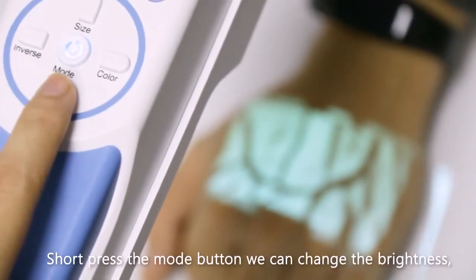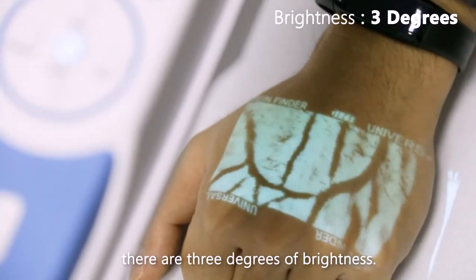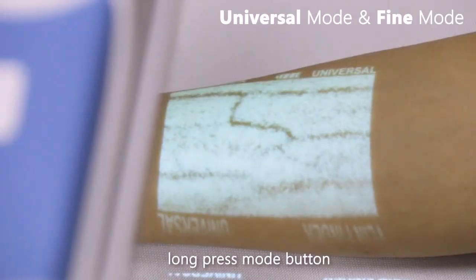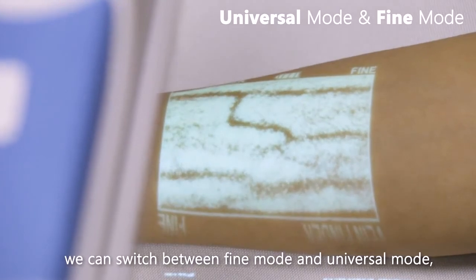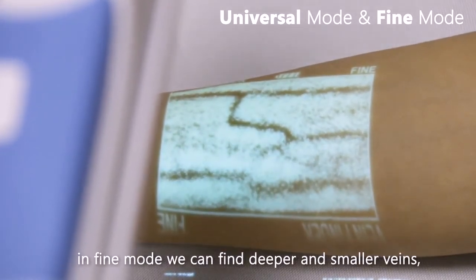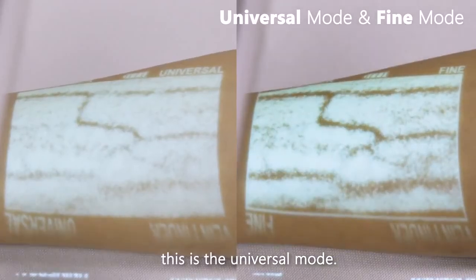You can also change the brightness — there are three degrees of brightness. Long pressing the mode button allows you to switch between fine mode and universal mode. In fine mode we can find deeper and smaller veins.